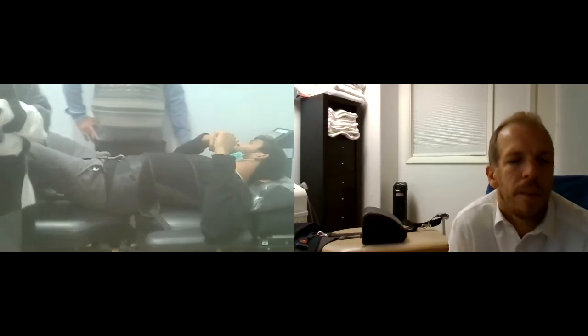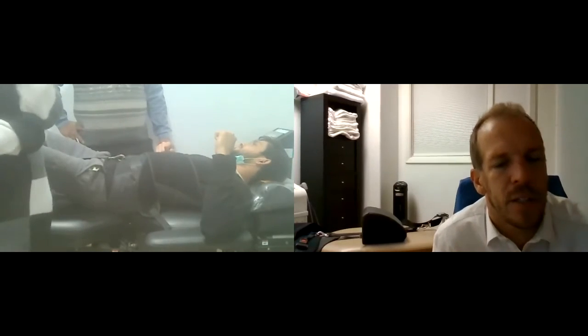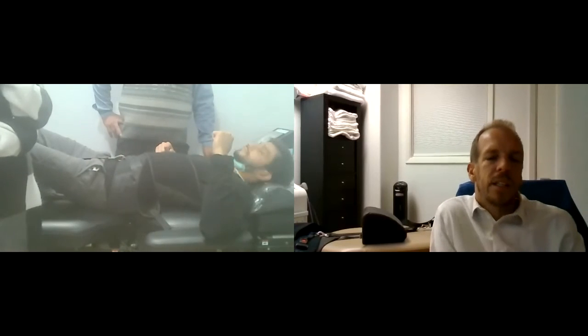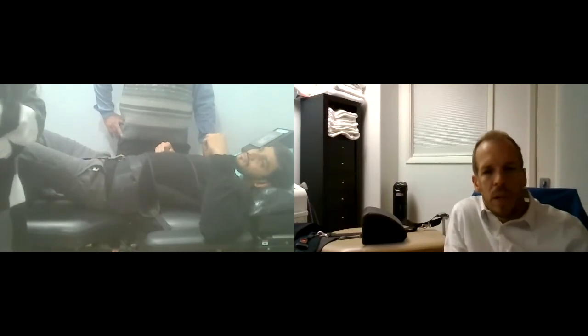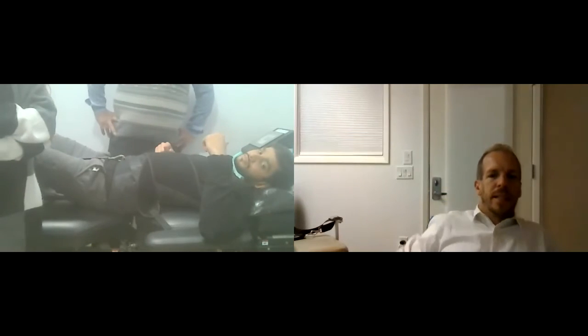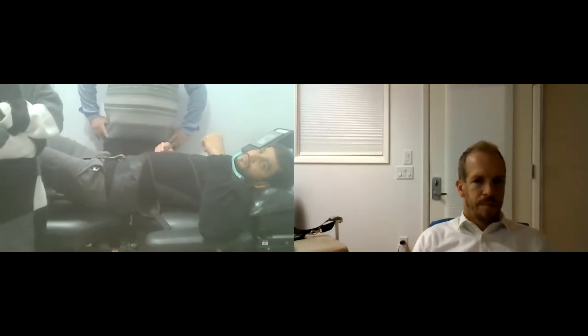Done. So now legacy number 1 is a very, very slow, very gentle treatment. It's the best treatment to do for the first 1 to 2 weeks. On everybody, I would start with legacy number 1, just to make sure that you don't make them worse. Give them a very slow, very gentle treatment.